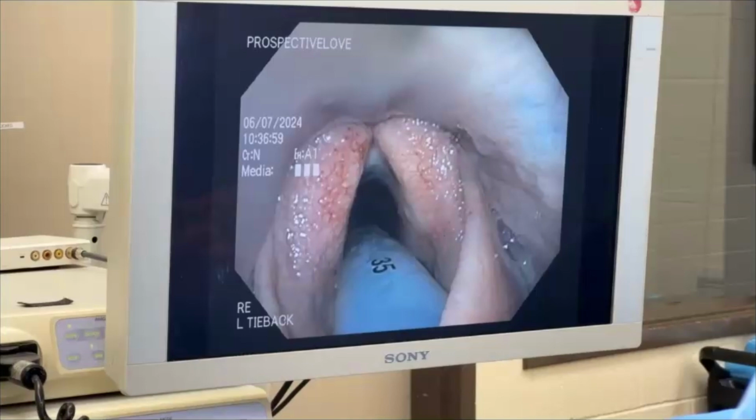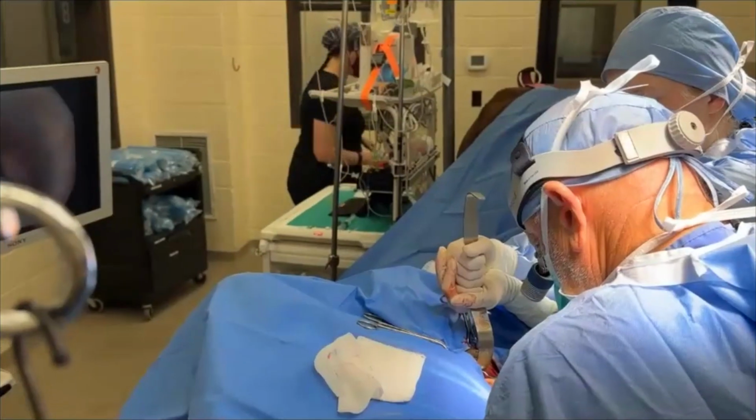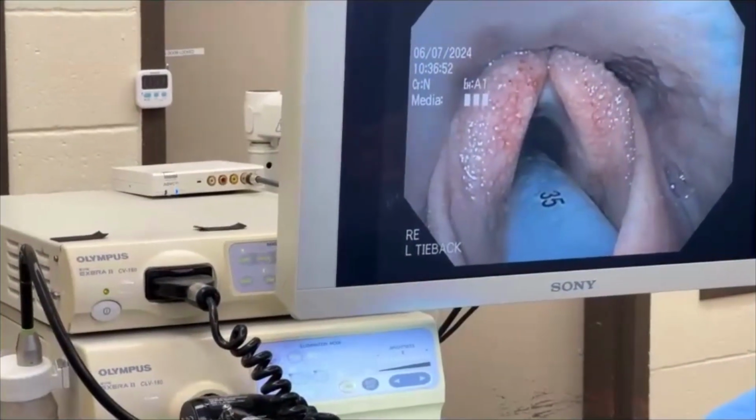Well, what I did is I tightened the sutures. I just pulled the ends together without tying it yet. I wanted to see how well I can abduct that arytenoid with that suture. Obviously I could pull it to where I wanted it, and you were happy with what you saw? Exactly. So now I haven't tied it tight yet. I am going to place another suture and make sure that one can do the same thing, and then I tie them both at about the same time. But that's what I wanted to see, how much I could abduct that.